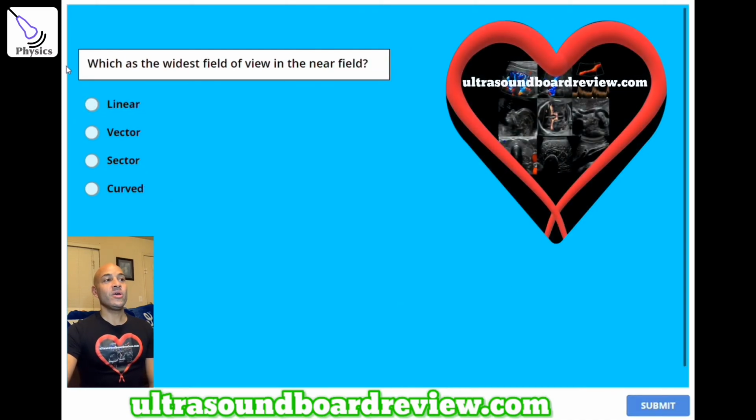Question number 18. Which has the widest field of view in the near field? A. Linear, B. Vector, C. Sector, or D. Curved?